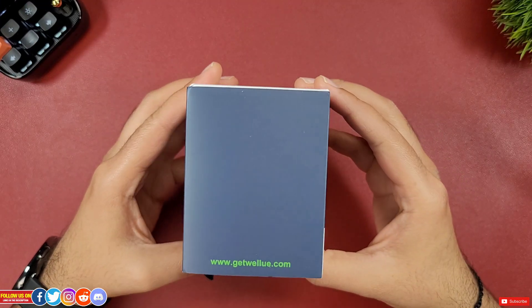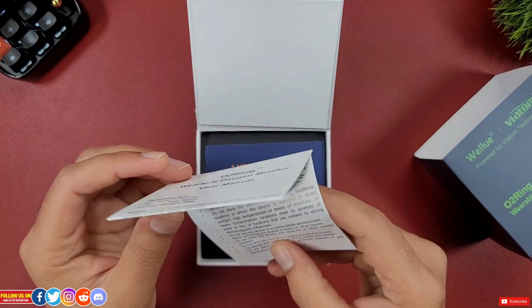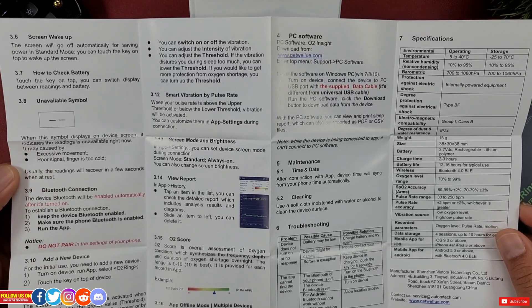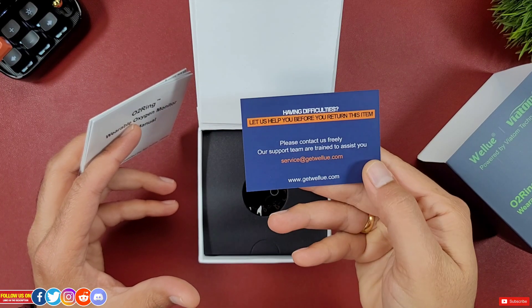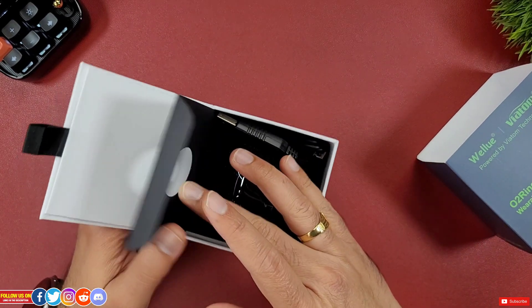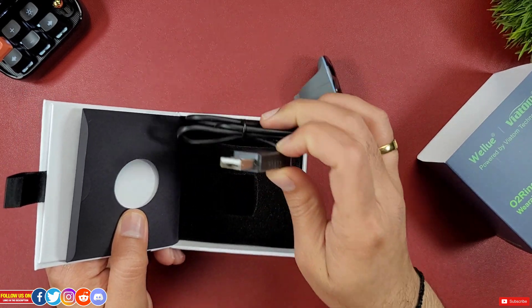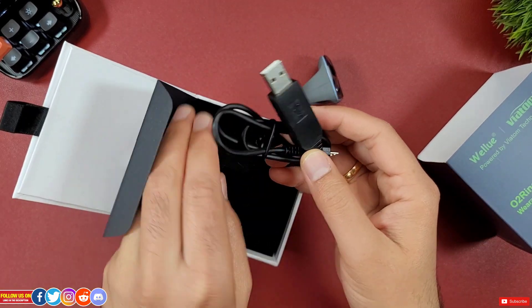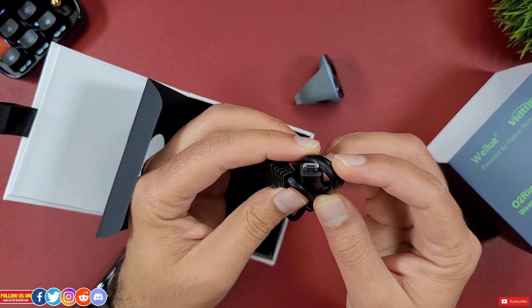It came in a box like this one. Inside the box is a user manual, which is pretty concise — you can pause the video to read through the specs. There is a one-year warranty card with their contact information. The O2 ring itself is also included, and the last item is the USB Type-A to micro USB charging and data transfer cable.